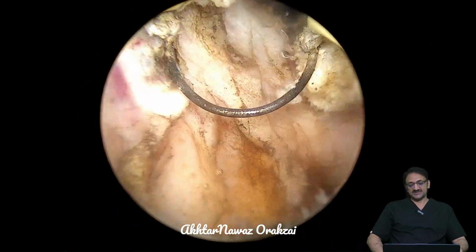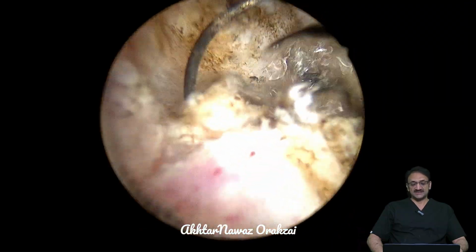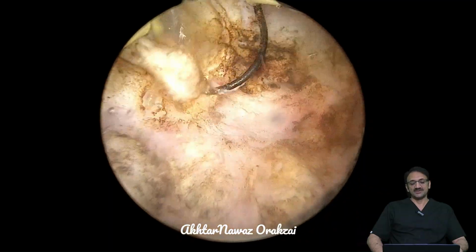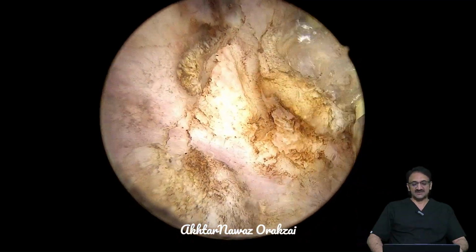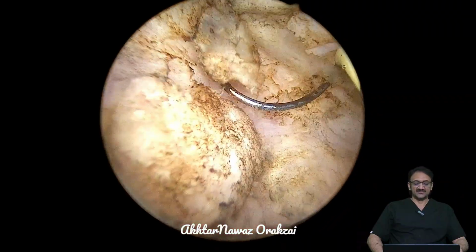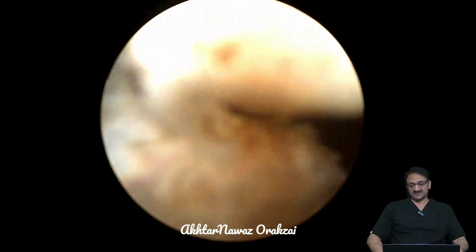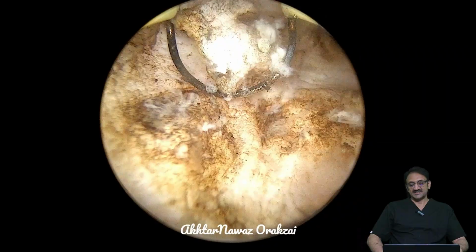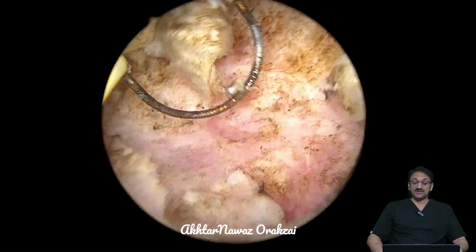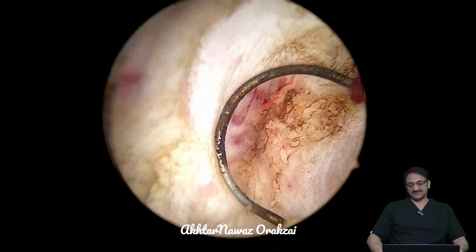The choice of surgery depends on many factors. However, till date, transurethral resection of the prostate with monopolar and bipolar is the gold standard for resection of the prostate, and the reason for that is the cost effectiveness. Of course, laser may be better in some aspects, but transurethral resection with monopolar diathermy is so far the most cost effective procedure.